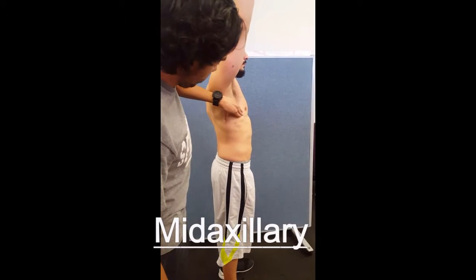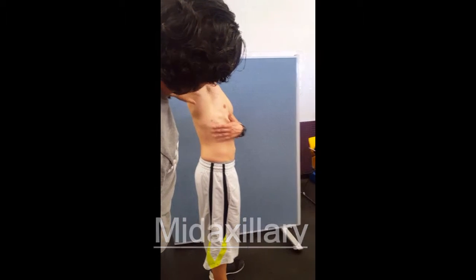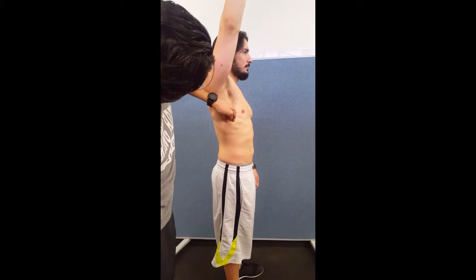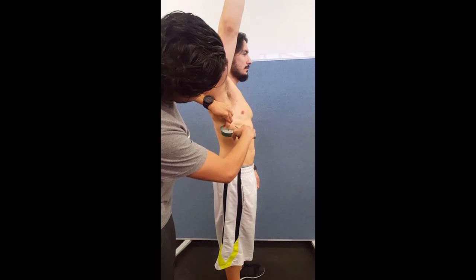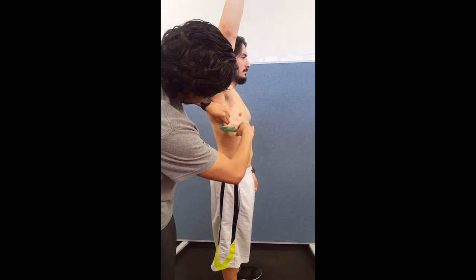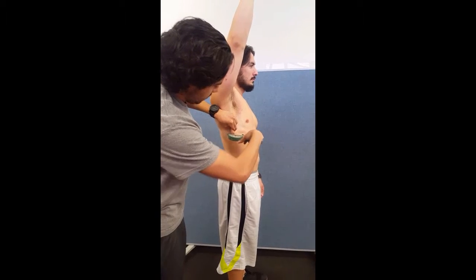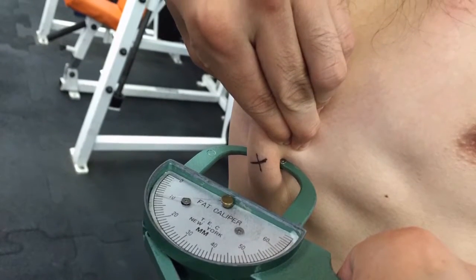As you can see, to start off with, we are measuring the mid-axillary. Throughout the video, you will notice that the subject is actually marked down with X's on the actual spots. For the mid-axillary, it is a vertical fold, and it is at the level of the xiphoid process of the sternum. You will notice that all measurements are done on the right side of the subject, and that is to be able to find a standard or a precise measurement.